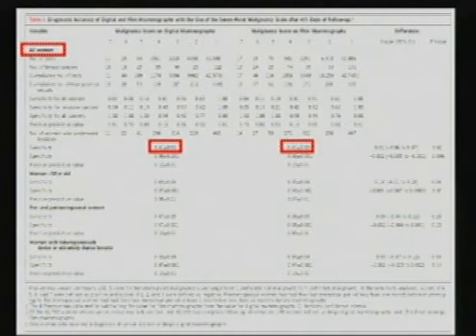Let's look at the sensitivity and specificity of the examination, again, using the 7-point scale that the authors want us to use. Looking at all women, the sensitivity of mammography on the digital examination was 41%. The sensitivity on the film screen, 41%. Now, yes, they were not different at all, and so that's why there was no difference in the cohort. But is that what we expect as the performance of mammography? We know it's not perfect, but is it this bad, with a sensitivity of only 41%?